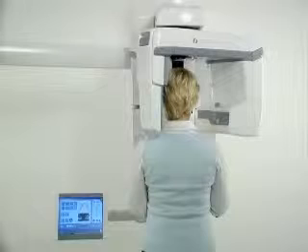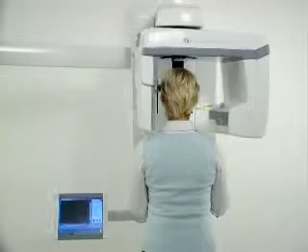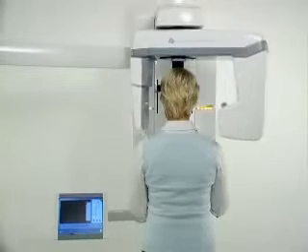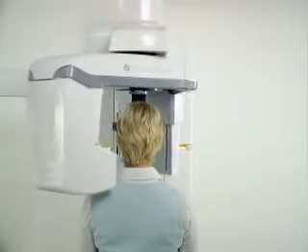After all movements have stopped, guide the patient out. Check that you have succeeded with the image and all five fiducials are recognized.